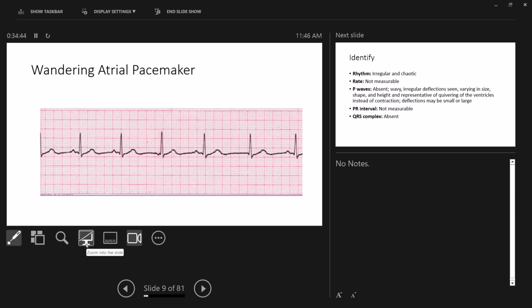Yeah, so what you do is you look at your very first P wave here, okay? That's number 1, okay? And then we look at this one right here, it's inverted. That's number 2, all right? And then we come over here and we don't have 1, okay? That's 3, and then we see this one right over in here. It's nice and rounded. That's 4. All you got to have is 3. Good question. Good question. Anybody else?